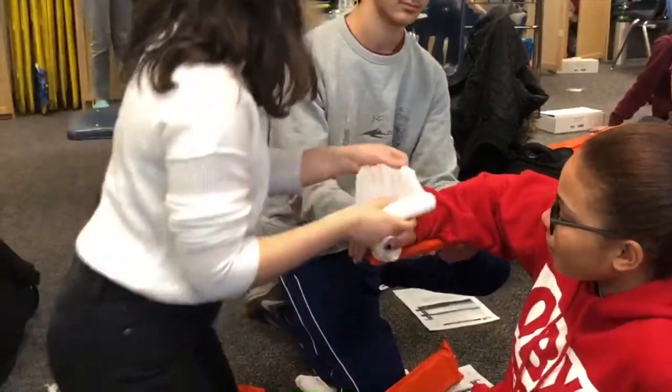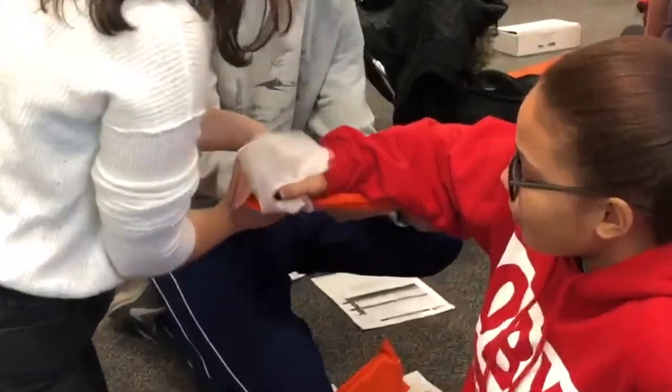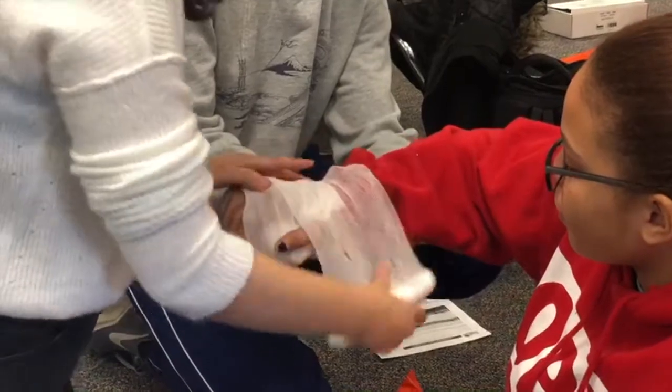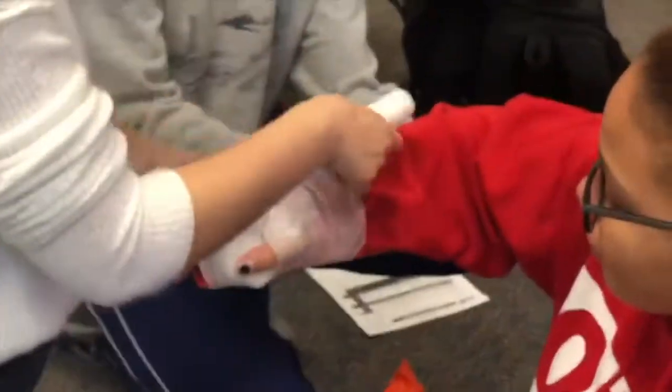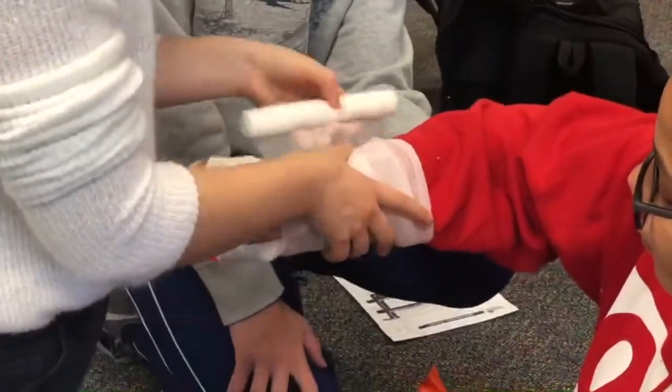Then you're going to take this, wrap between the thumbs, and then just wrap around the hand like this, all the way up, and make sure it's fairly tight — but not like squeezing their circulation off.